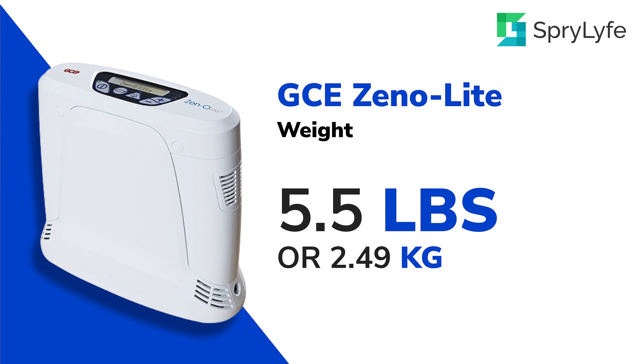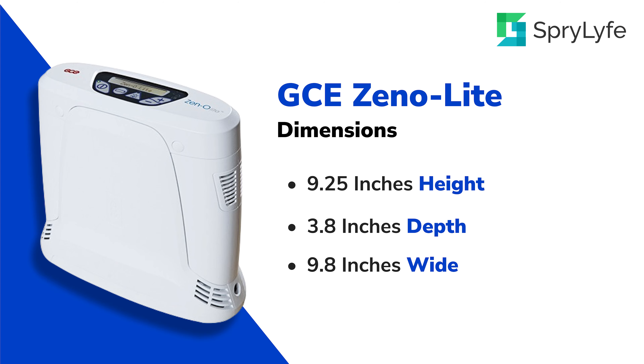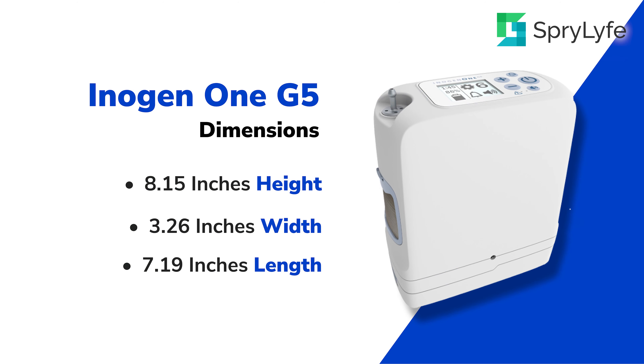All right, so first we're going to go over the GCE Xenolite. That machine comes in at only 5.5 pounds compared to the Inogen 1G5, which weighs in at 4.7 pounds. The GCE Xenolite dimensions are 9.25 inches high by 3.8 inches deep and a width of 9.8 inches. Now let's compare to the Inogen 1G5 at 8.15 inches high, 3.26 inches wide, and 7.19 inches long.